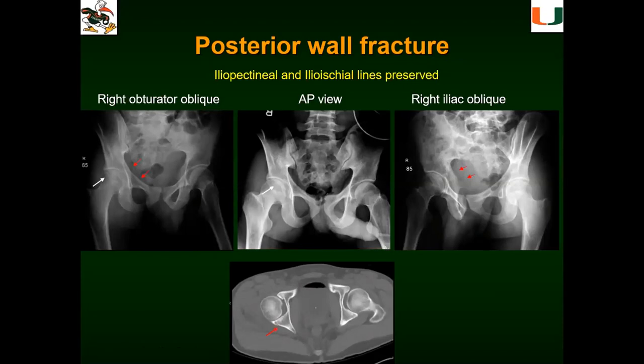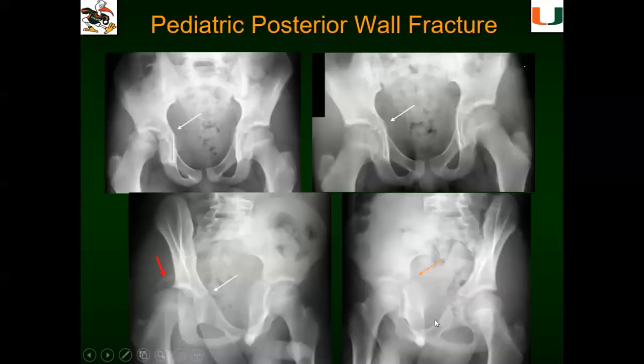Again, in our patient population, with these posterior rim fractures, what I tend to see a lot in my football players is that they'll transiently posteriorly subluxate or dislocate, and you'll have concomitant cartilage shear injuries. So you'll have disruption of articular cartilage, usually in parafoveal margins of the femoral head. So we will obtain MRs looking for that articular cartilage injury. And when I see that chondral shear, the full thickness cartilage shear injury of the femoral head in parafoveal margins, I know that the patient has had a transient posterior subluxation, whether or not I see the concomitant posterior wall fracture or a posterior labral fracture. So usually that's the mechanism that I see.